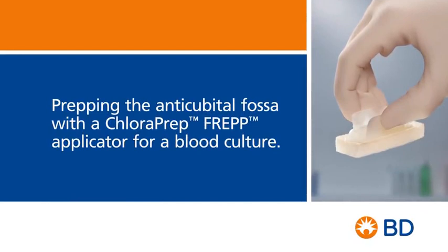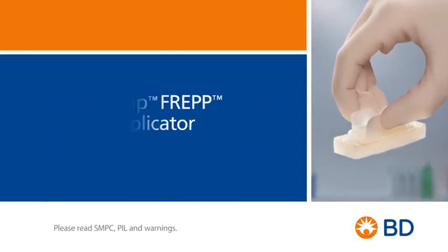In this video, you will learn how to prep the anti-cubital fossa for a blood culture with a Chloroprep FREP applicator.